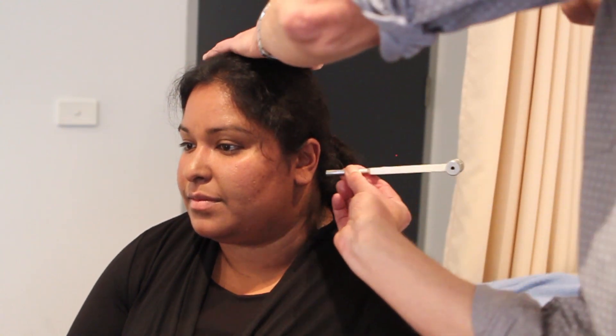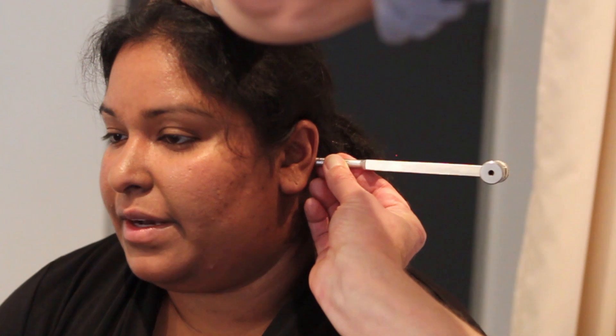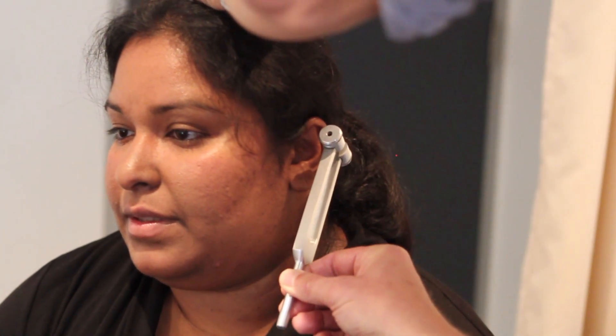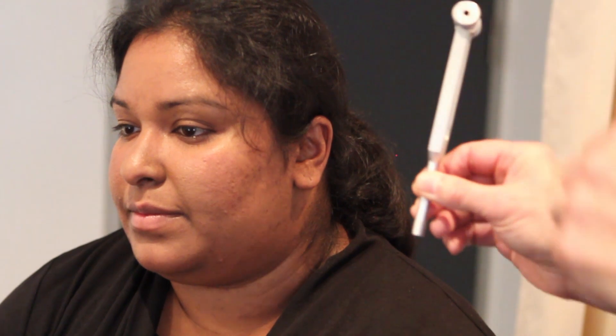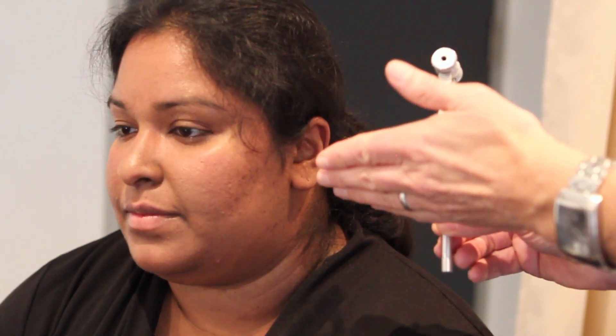I'm going to place it there. Please tell me when you stop hearing the noise. [patient: Now.] Can you hear it now at all? [patient: Yes.] Okay. Now that is a positive test because the air conduction is continuing — is still audible — even though the bone conduction has been lost.